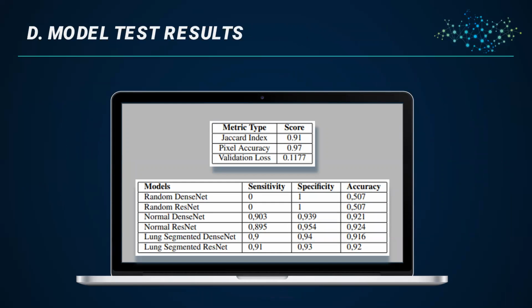First table presents results for the lung segmentation model. Results are promising in terms of segmenting lung areas in X-ray images, even for various datasets. Second table presents results for our classification scenario for different networks, different labeling techniques, and lung segmented support. Models using segmented CXR images presented results similar to the models that use non-segmented images.